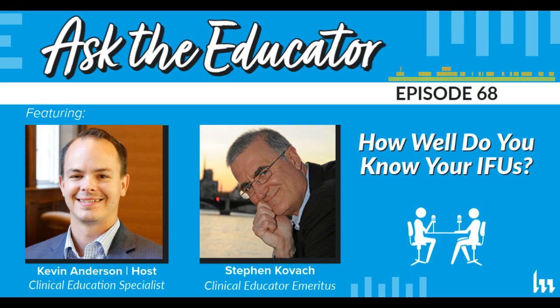But now you're not switching, and that's, again, a manager understanding their workflow, their staff, how many sonics they have, the time, because you don't want to do less than a minimum, but you can always do more than the minimum. Correct, Kevin? Yeah, I mean, unless the range doesn't allow for it in the IFU, but true.